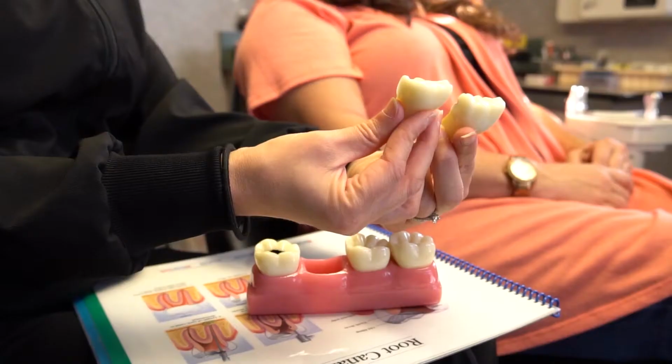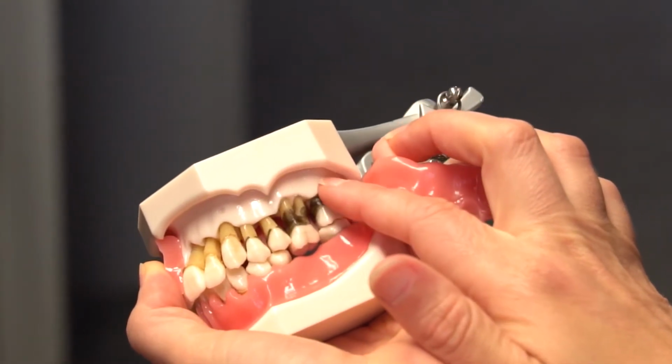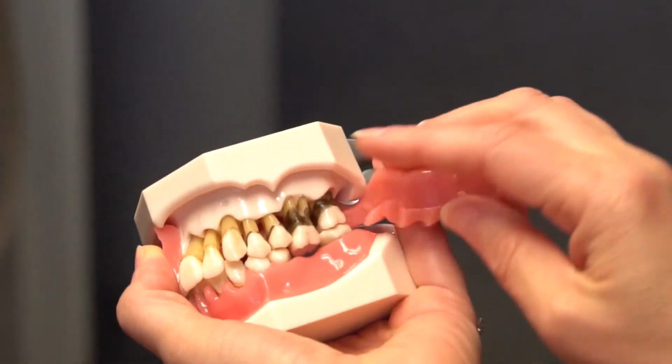Bite wing x-rays, sometimes referred to as checkup x-rays, are the best type of x-rays for diagnosing cavities in between the teeth. If x-rays are taken once a year, cavities can usually be diagnosed and treated while they're still small, before they can progress deeper into the tooth. X-rays are also important in helping diagnose gum disease, as they can show loss of bone support around the teeth, which is the hallmark of periodontal disease.